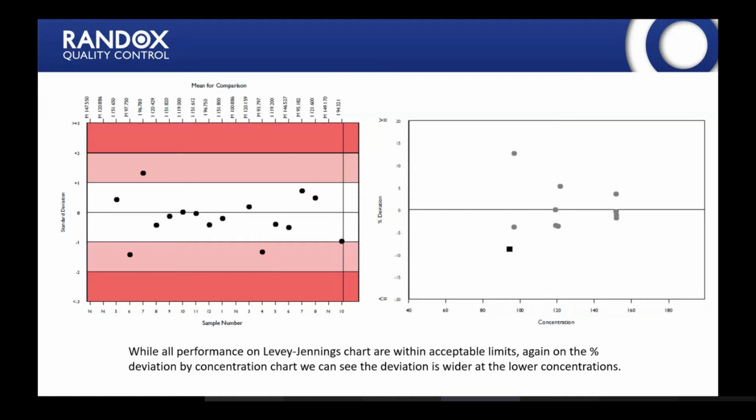And this means, so Stephen had showed how an instrument that has a bias would appear on the histogram. So if your instrument has a bias and there's less than 5 in your group, you'll end up being compared to the method mean, and you may find that for the samples where you run the method that you have a bias appearing here. So that will be reflected again on this chart depending on your level of comparison. But here in this instance again, you can see at the lower concentrations, when we're looking at the instrument comparison, that the lab again has a slightly wider spread at the lower concentrations than they do at the higher concentrations.